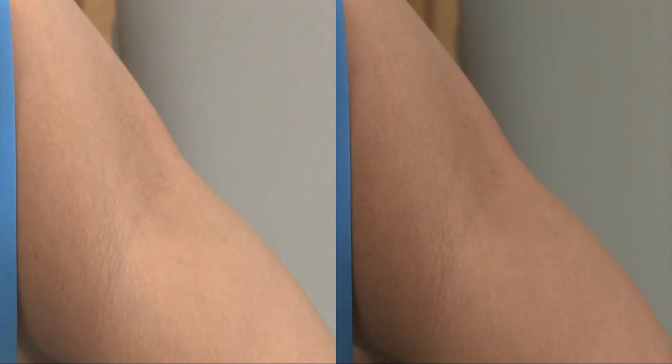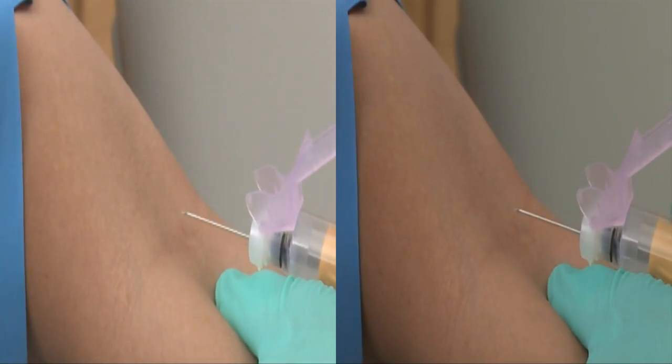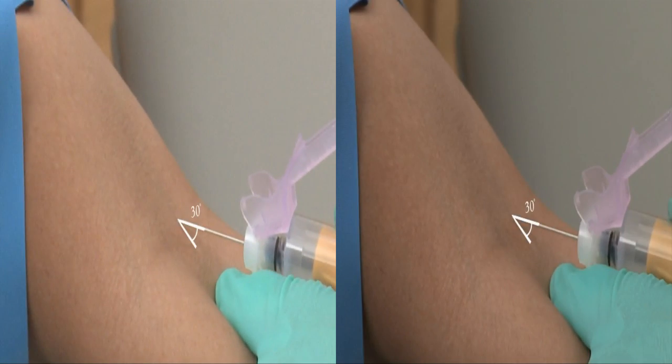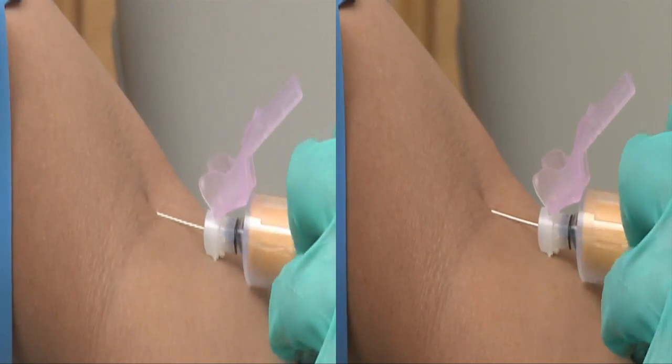Let's take a few moments to review. Position the needle, bevel side up, and line it up with the vein. Position the needle to form a 30-degree angle with the surface of the arm. With a single short but firm motion, swiftly insert the needle through the skin and into the vein. Push the evacuated tube onto the needle when the needle enters the vein.